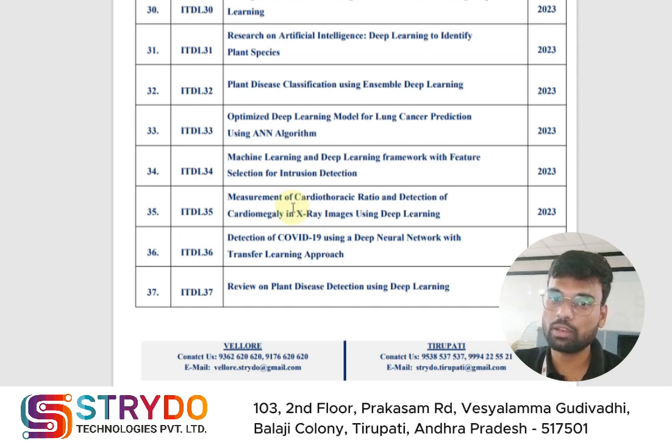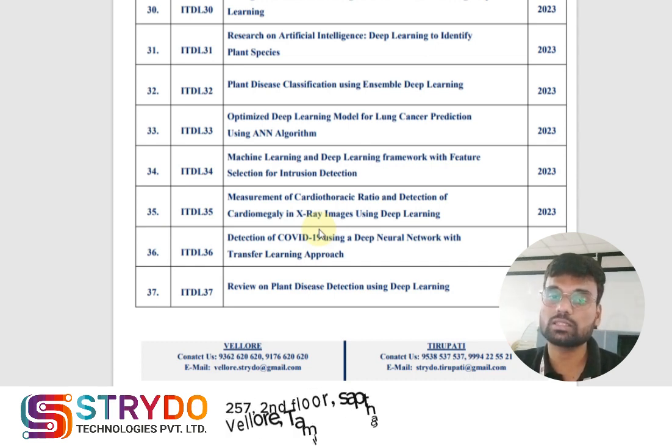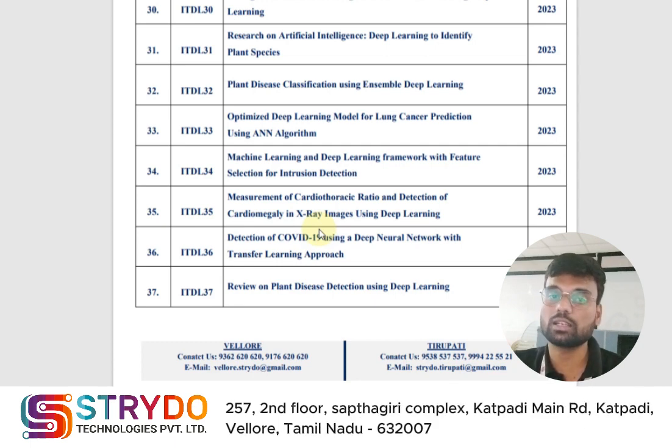When we see the chest X-ray image, we can say whether cardiomegaly is there or not, by using deep learning algorithms. Deep learning algorithms work on image data. Here we create neural networks. A neural network has three parts: the input layer, the hidden layer and the output layer.